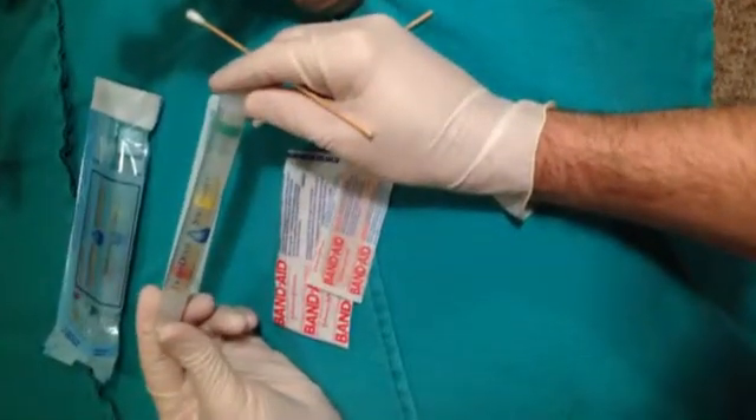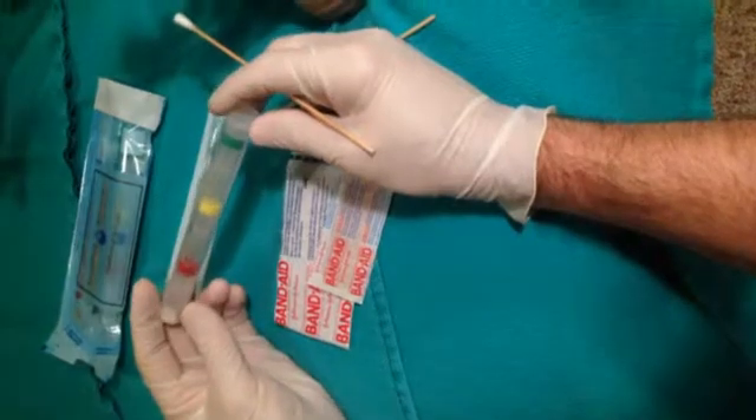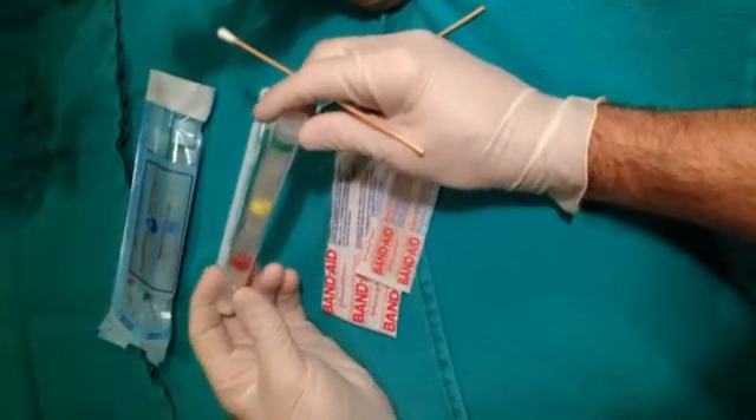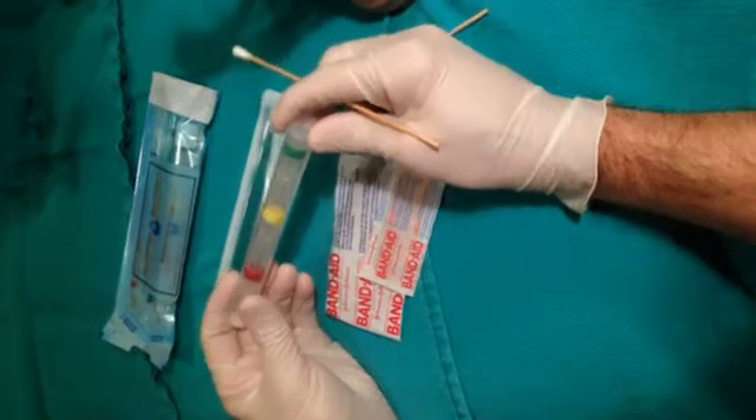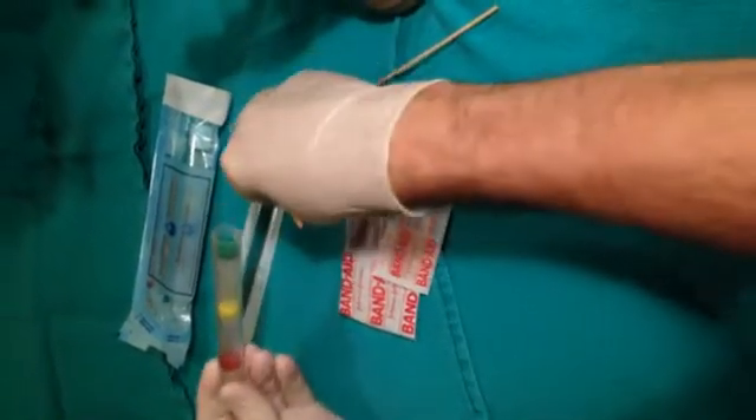The solutions that we'll be applying are contained in this test tube, which helps to control the humidity in this area. The solutions are very sensitive to ambient moisture, and that will degrade their ability to perform the treatment.